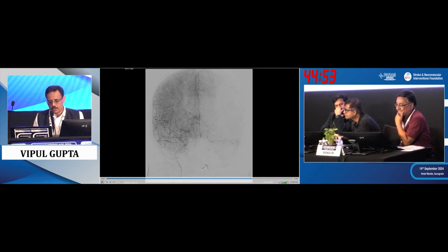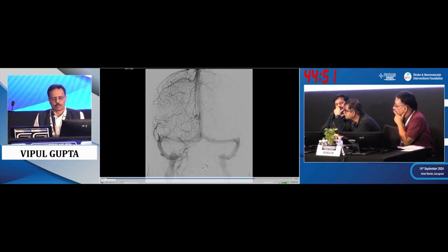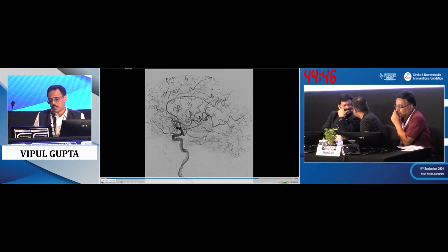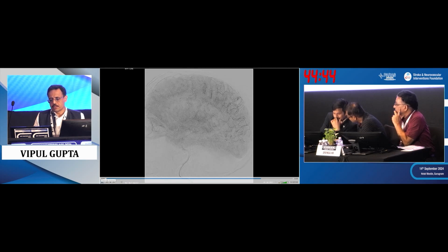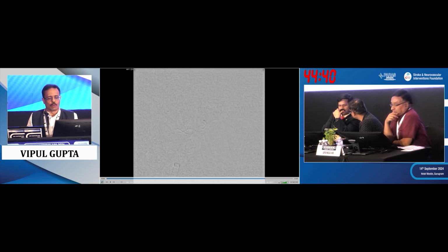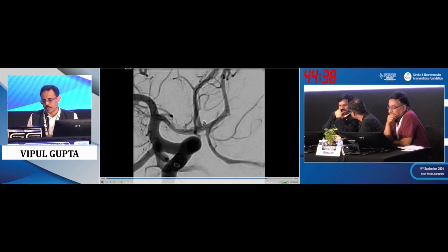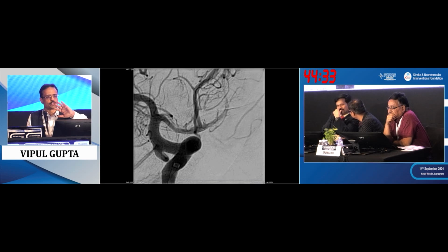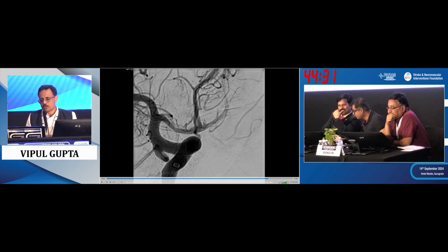So these are blister-like, but they're not blister aneurysms. To us, in acute SAH condition, a flow diverter is not an option. And one can do this technique, what we call the microcatheter resting over the stent technique, to coil very, very small aneurysms. Take your time. You can see some coil tip is here in the ACOM, but the stent is pushing it against the wall. It doesn't matter. Small coil tips like this.